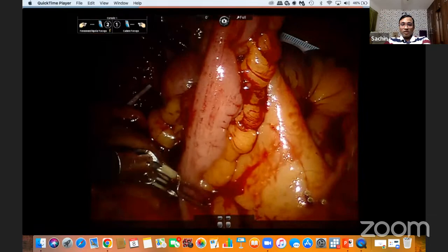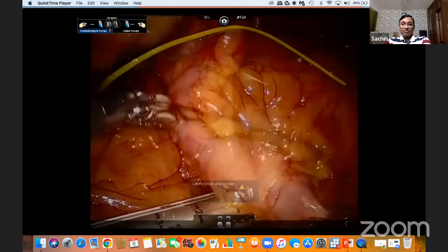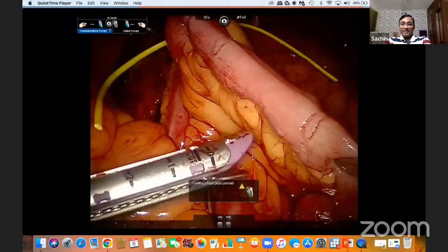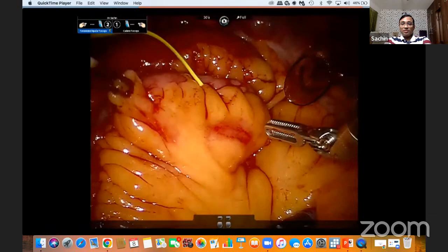I take the proximal end of this bowel to the sacral promontory where my ureteral anastomosis will be. So that will be the length of my conduit. Sometimes you take 15 centimeters and it doesn't come to the anterior abdominal wall. So what I feel is this is the ideal technique: measure from the anterior abdominal wall till the sacral promontory where you are doing the ureteral ileal anastomosis. So this is the length which I got. Another endo GIA stapler, similar principle, perpendicular to the mesentery, perpendicular to the bowel. Make sure that you don't have anything else below.